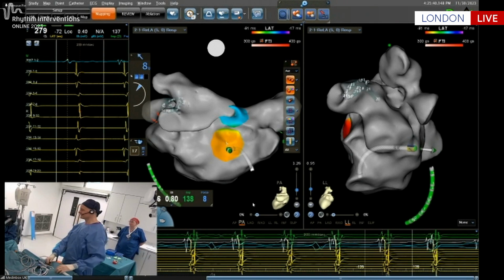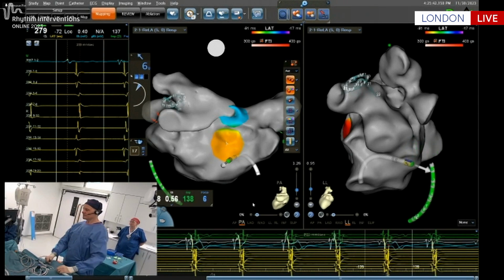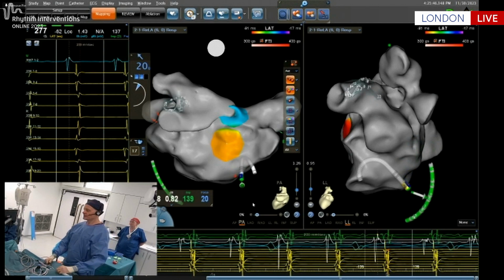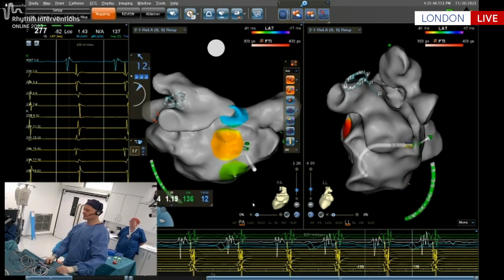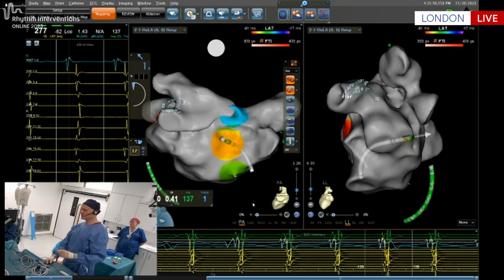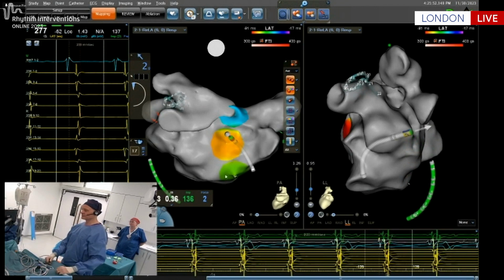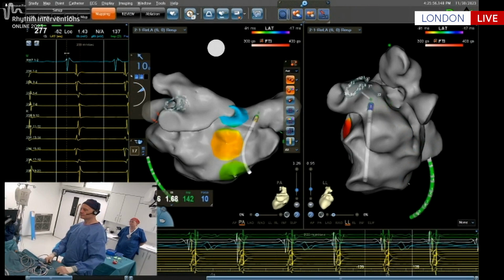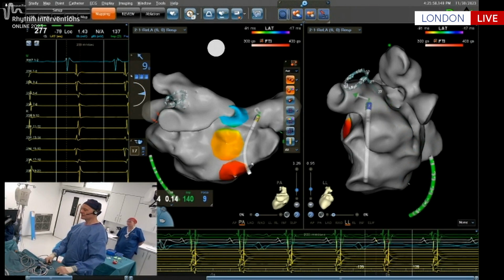I think that's what I said. So both on the anterior and the posterior walls, the activation is going from inferior to superior. Can you just retime that one on the Carto, because it's not picked that up properly? And AP view again.